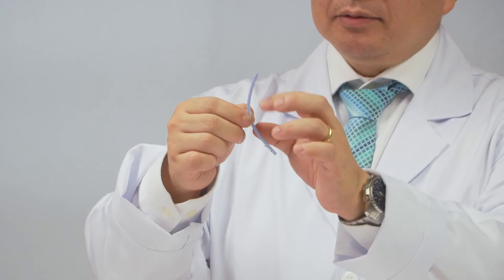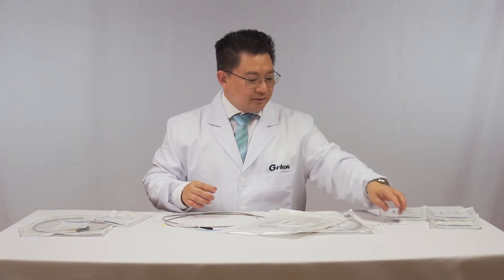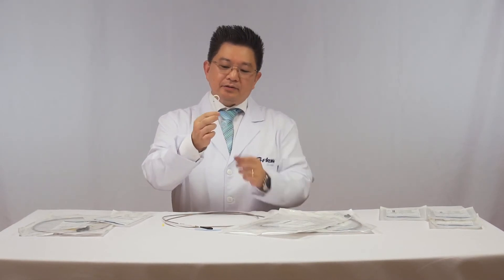It anchors in the distal part, in the proximal part, and in the middle part of the choledochal. Another type of plastic stent is this — it's a pigtail type.